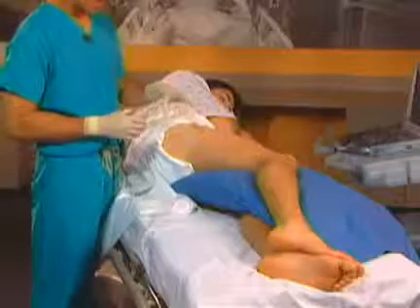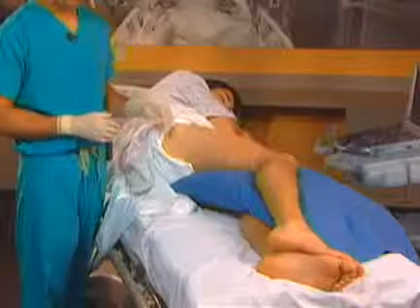To position patients for the subgluteal sciatic nerve block, we position the patient lateral. This way the patient is comfortable, they can be well sedated, and you can place a probe on the posterior side of the leg and advance the needle from lateral to medial.